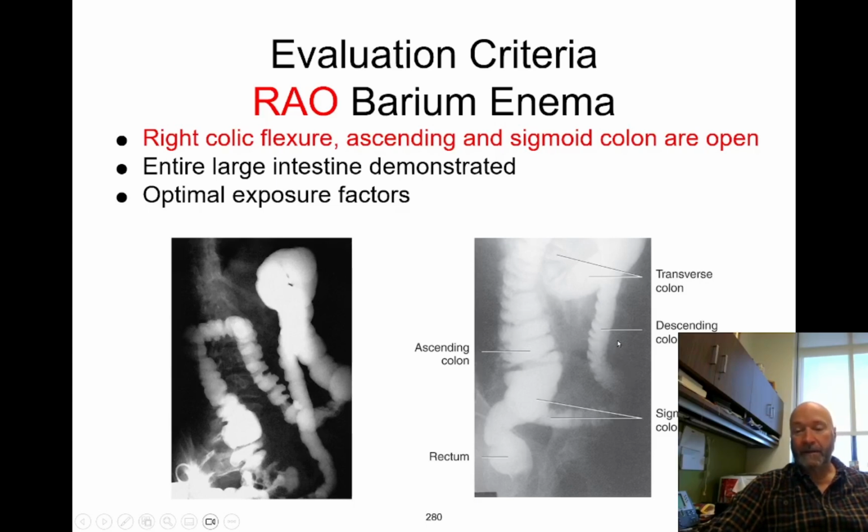They positioned at the iliac crest, or maybe even slightly below it. That looks like femoral head there. And neither one of the flexures are on that image. So to me, this is a completely useless image. And even though this is not textbook positioning, it shows the anatomy that we want to see. And because of that, I would pass this and I would not pass that.